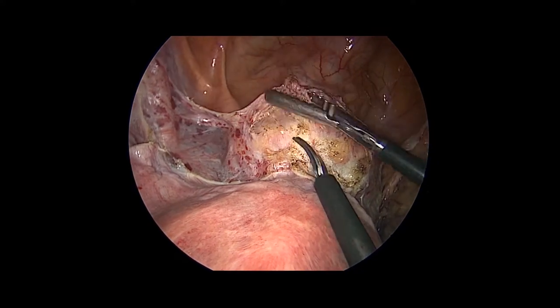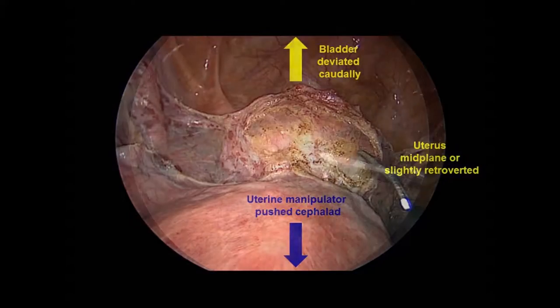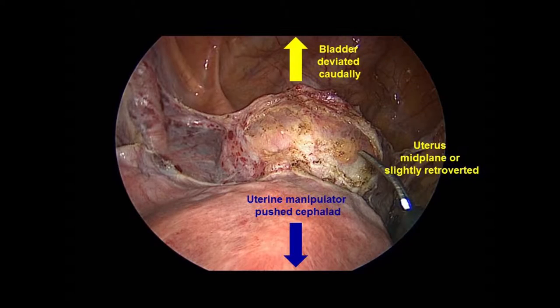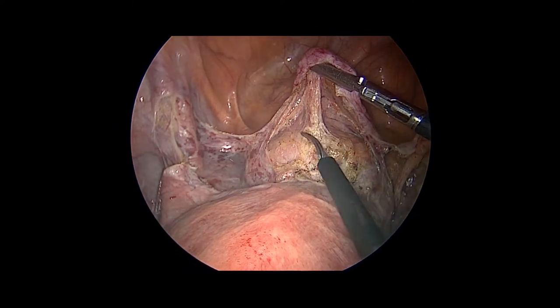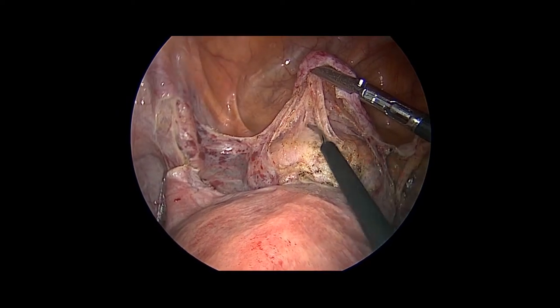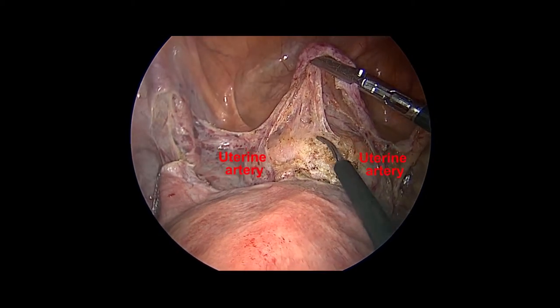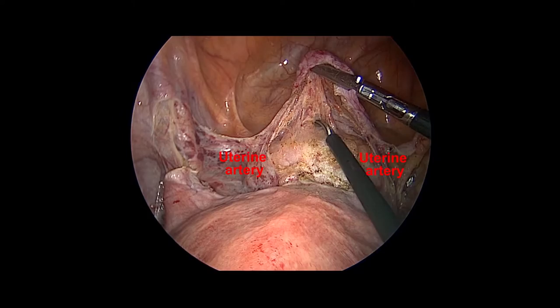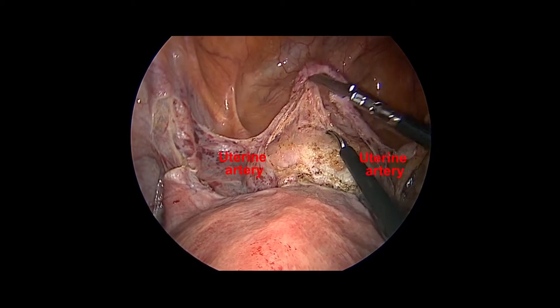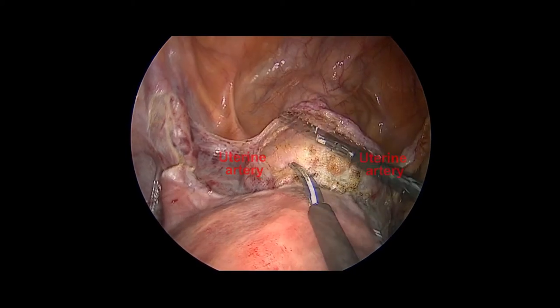It is essential to have the uterine manipulator pushed cephalad to deviate the bladder caudally. The uterus is midplane or slightly retroverted. Care should be taken to avoid lateral dissection, where the bladder pillars and uterine arteries border the space.